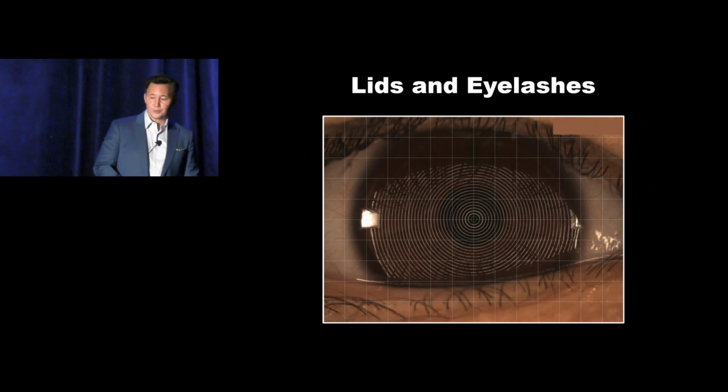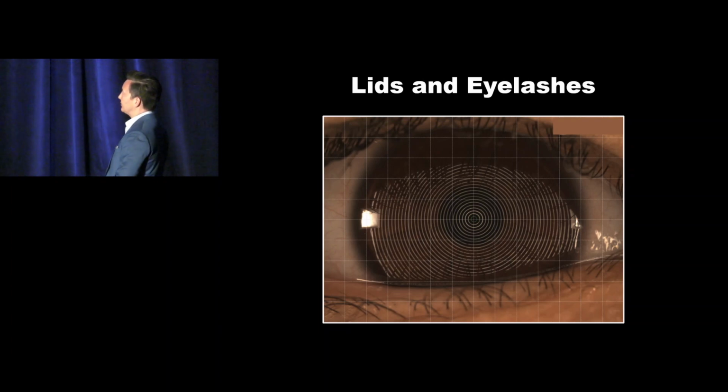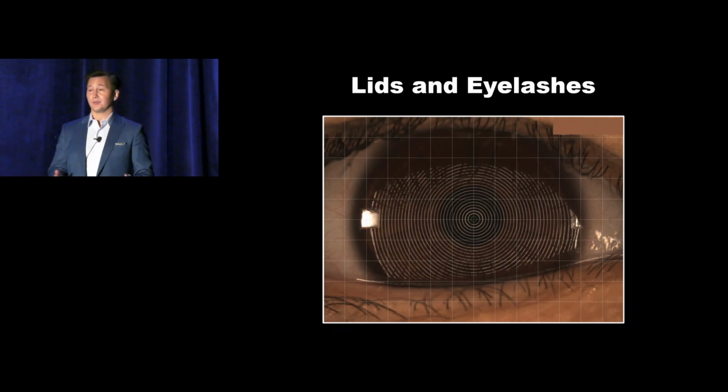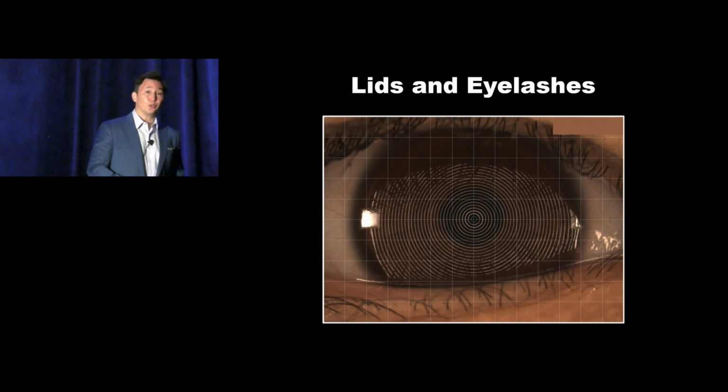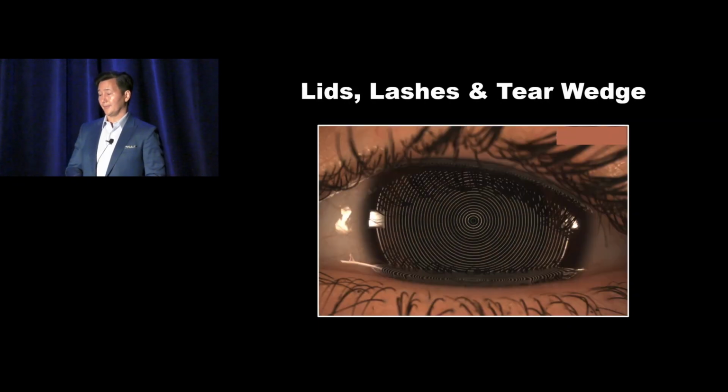Here we've got issues with both the lids and the eyelashes, and it's creating a massive shadow up here where there's just no data. And we've got to get information there, because if this is a with-the-rule cornea or a spherical cornea, we need to understand the shape of the eye vertically so we can choose the appropriate depth of lens for that axis. So it's not just the horizontal that matters. We want both meridians so you can build the appropriate shape for the two principal meridians of the eye.